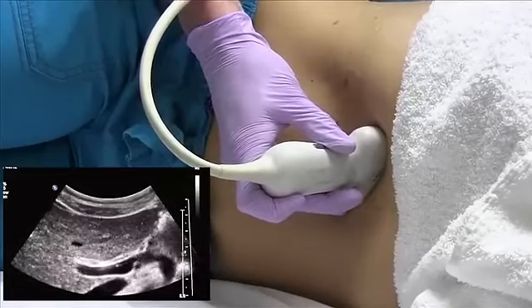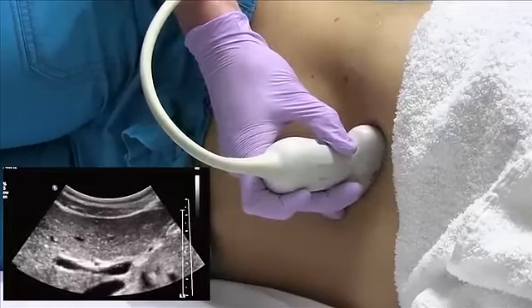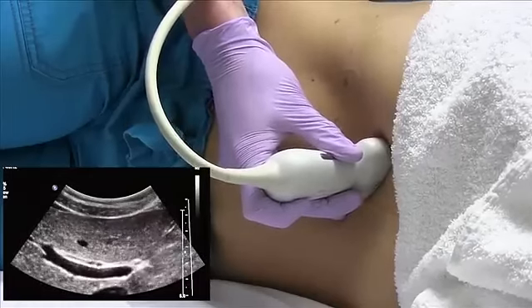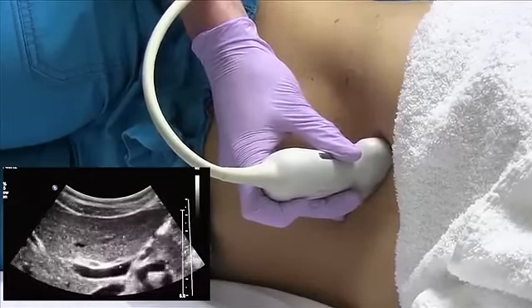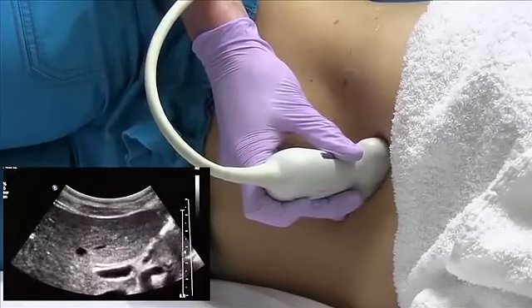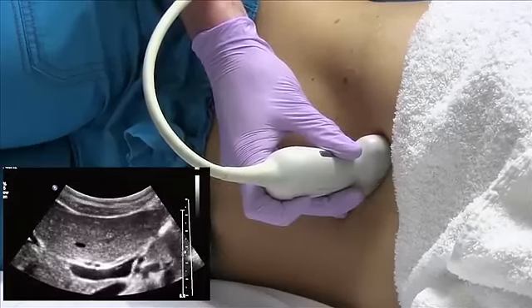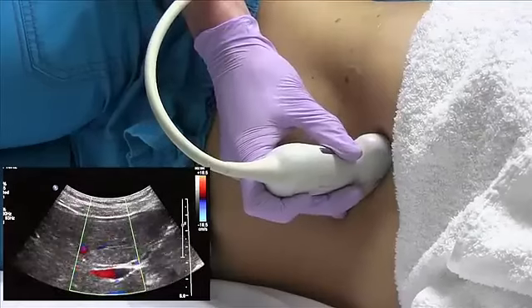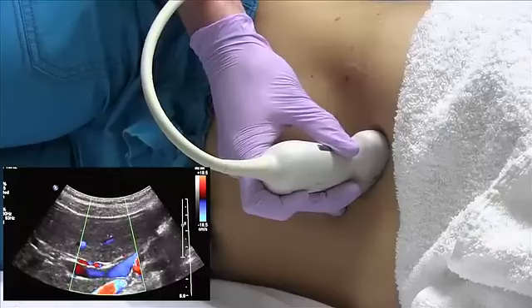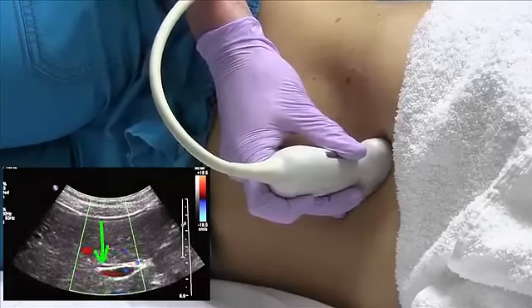So you just keep tweaking the probe until you elongate one of these tubular structures next to the main portal vein. The easiest way to see if you're on the hepatic artery or the CBD is to turn on color and see if it lights up. If it lights up, you are on the hepatic artery, and if it doesn't, you know that's the CBD.